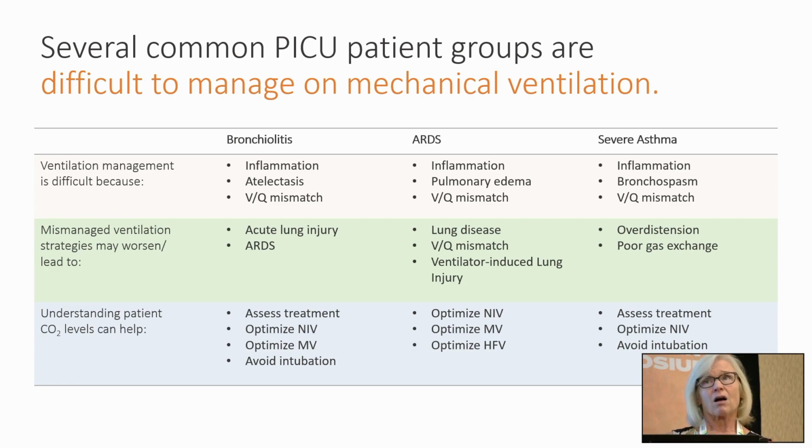When we are managing our patients on the vents, all patients, even adults, we look at a couple of things. In fact, when you think about it, as a respiratory therapist, everything we do comes down to two things. Everything we do is for one of two reasons, either to improve oxygenation or to improve ventilation. Would y'all agree with that? It's either one of those two things, or most likely both, right? And we're always watching the oxygenation. Now that we have pulse oximeters, they're ubiquitous. Everybody gets a pulse oximeter.